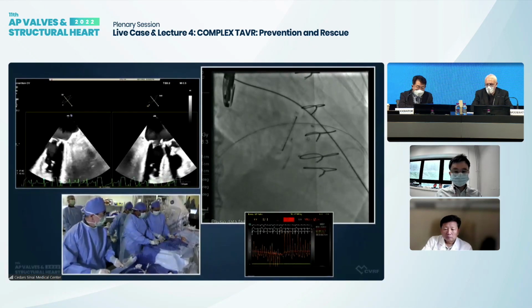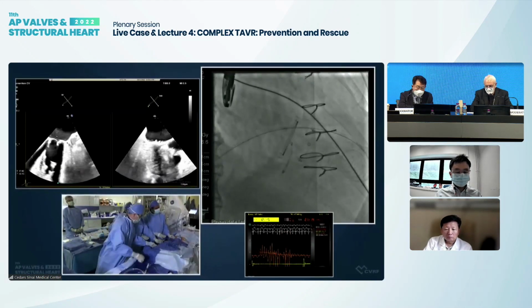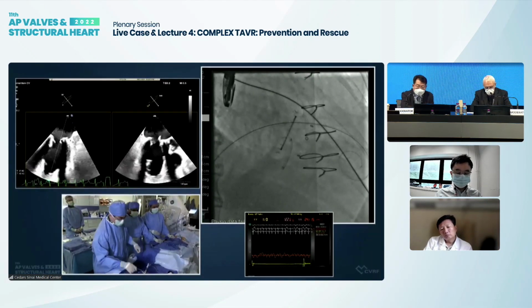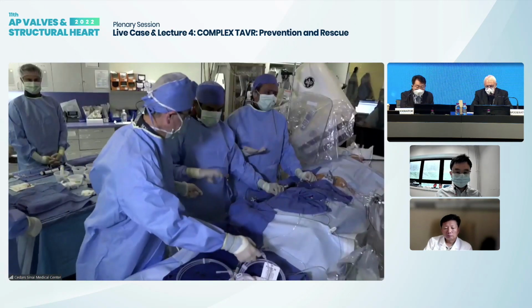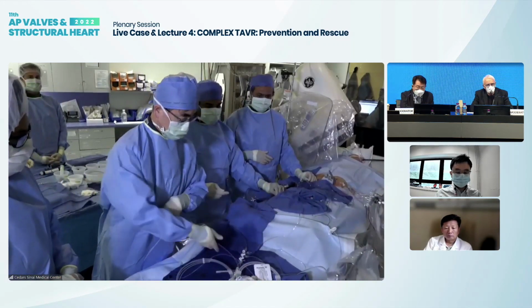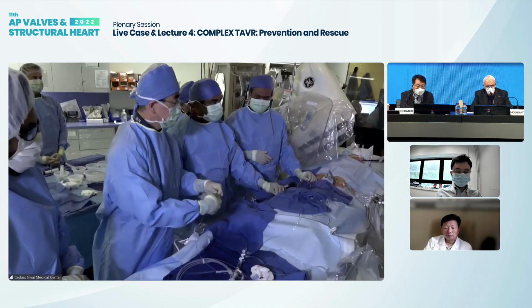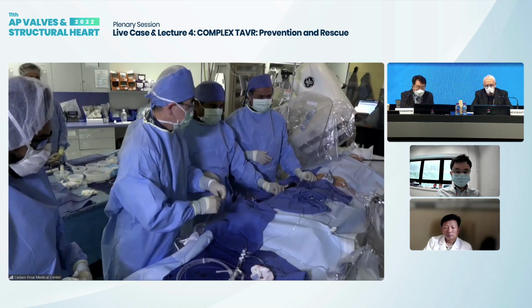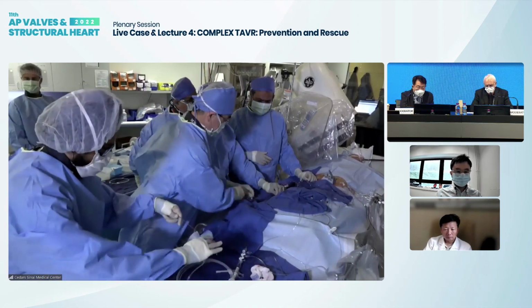Now, Jubin, as soon as this comes out, please walk the Agilis catheter back. You want to do the balloon through it? Actually, it's a good point. We will use the Agilis catheter to support our balloon as we do balloon septostomy. It's a very important remark that Raj just made: watch the wire at the apex. Don't lose the wire position in the apex, for various reasons. It's a small comment, but very important for those not that familiar with the procedure. Thanks, Raj.